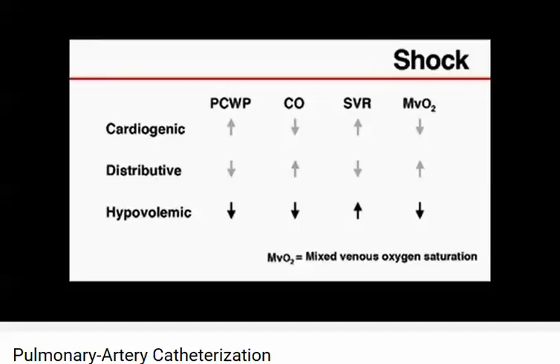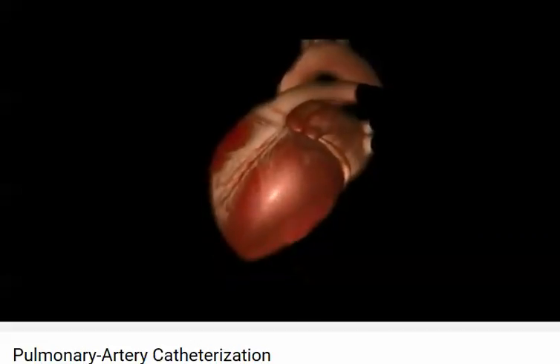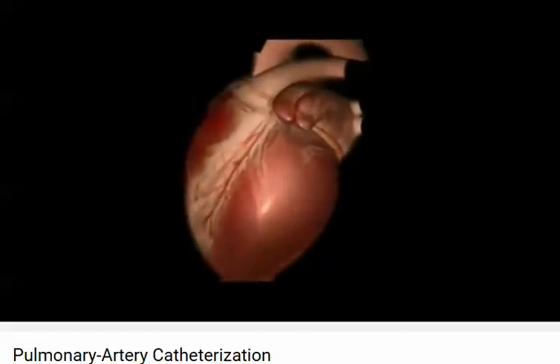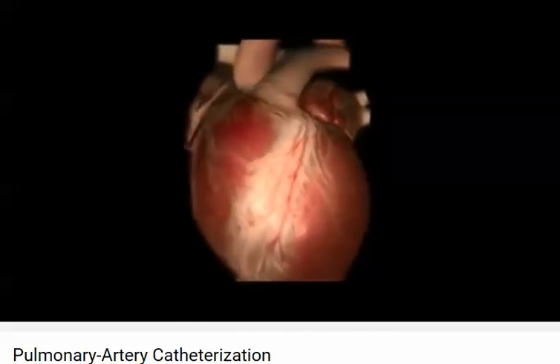It is possible to diagnose many more conditions by examining pressure waveforms. For a complete discussion, please consult the supplementary appendix that accompanies this video, available at nejm.org.